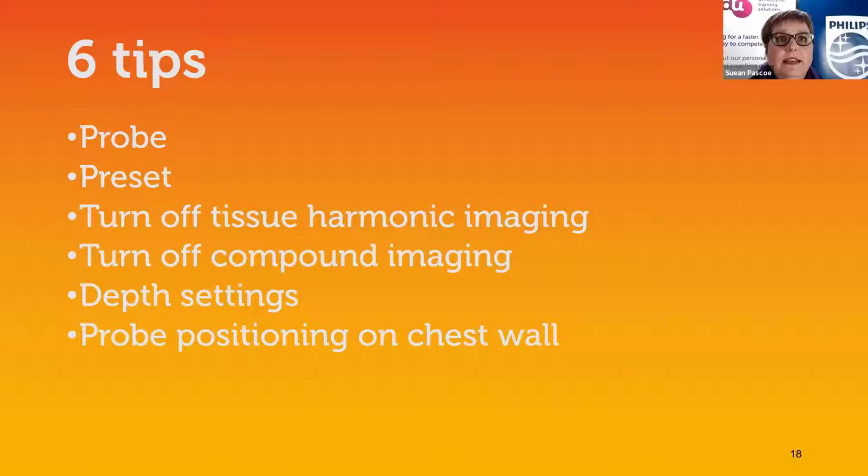So does anyone have any questions at this point before we move on to our next topic? I've got colleagues who have mixed opinions about using M mode for lung ultrasound when looking for pneumothoraces, and I just wondered if you guys had strong feelings on using M mode to increase sensitivity at picking up those small pneumothoraces, where sometimes looking at the actual image can be a bit tricky to see the lung sliding or not.